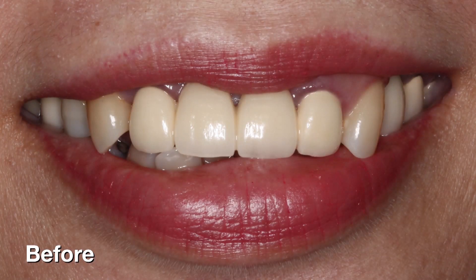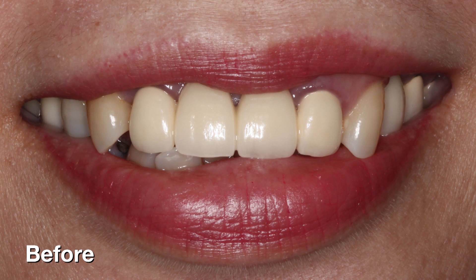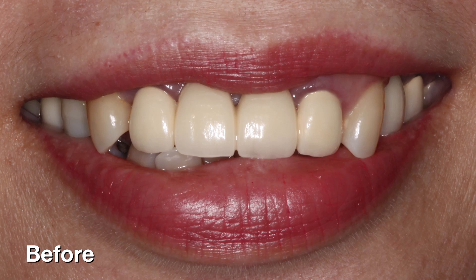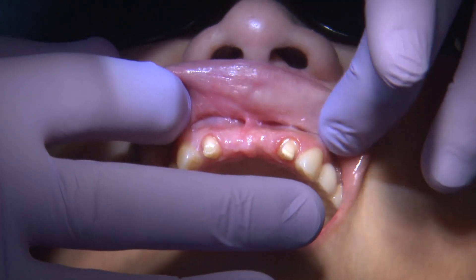Welcome back to the Chairside Case of the Week. My name is Dr. Urbay and I want to share a very special case with you. This patient came to our clinical operatory here at Glidewell with an existing fixed dental prosthesis spanning from teeth number 7 to 10, and she requested that this bridge be replaced — first for aesthetic reasons, but also because there were some open margins around this restoration.